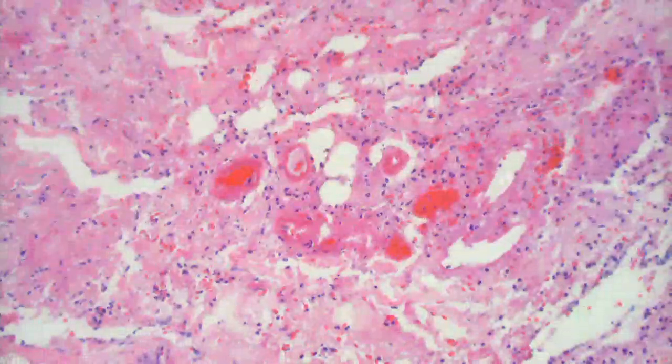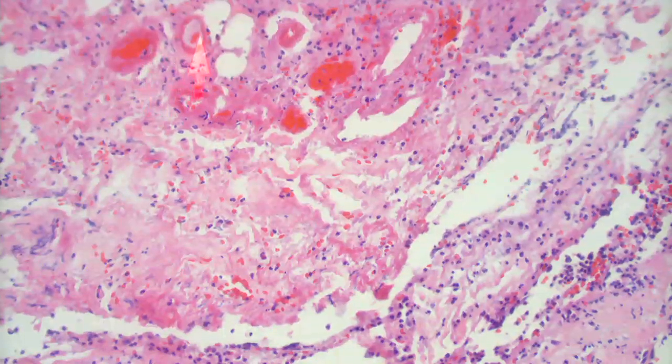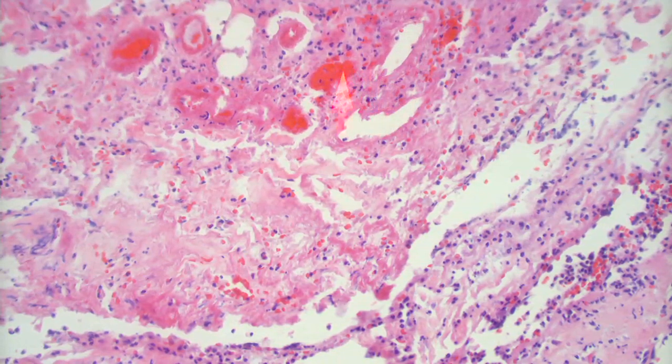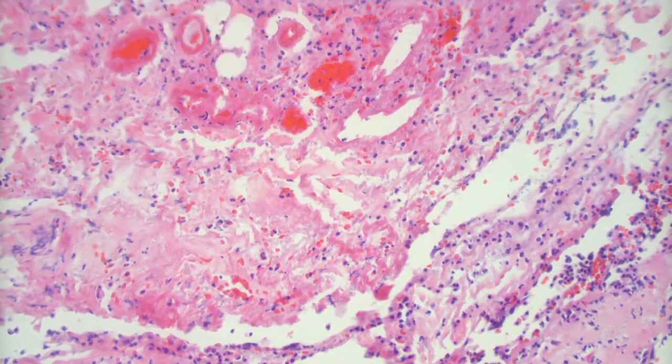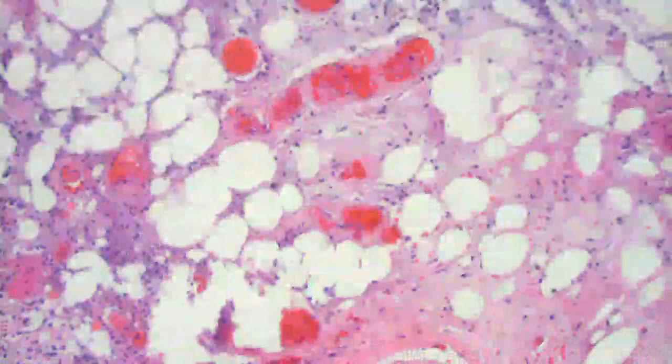What about these blood vessels? There's fibrin, and yeah, they look sick. Fibrin in the wall of the blood vessel, they're all thrombosed here. Okay, and there's all these polys. So we think this is a leukocytoclastic vasculitis? I'm leaning more towards infections.